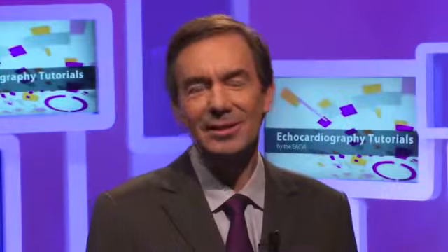So the main points regarding this presentation is that we have not only to assess the morphology of the valve, but also to look at the reparability of the valve. And finally, to use an integrative approach to quantify the severity of mitral regurgitation.